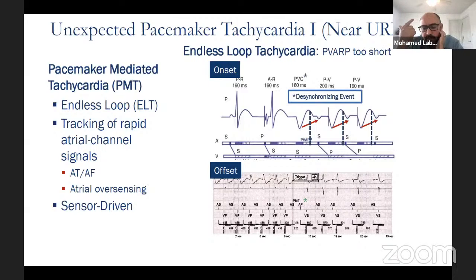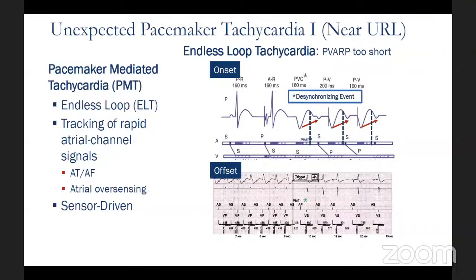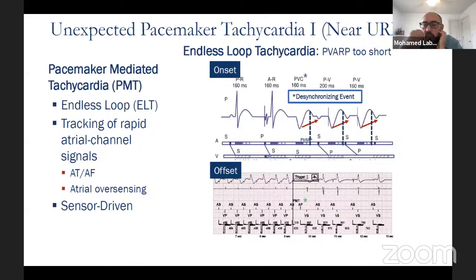As far as monitoring devices, first of all, why would you put a monitor on a patient with a pacemaker unless you have a doubt about the pacemaker? No, I mean those notification devices, like older folks who have a device they push when they're in an emergency. I think that's what I understood. Yes, that's right. So that's safe. Yeah, that should be okay.